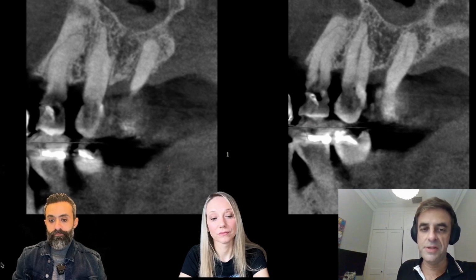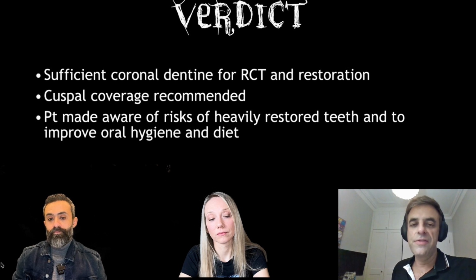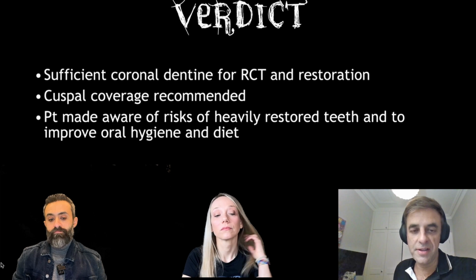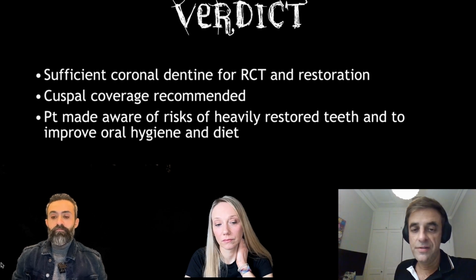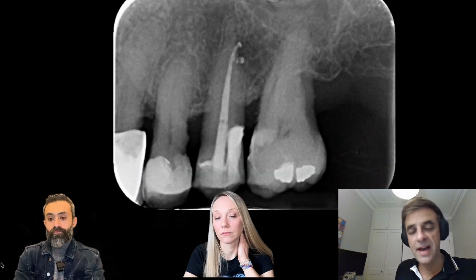So if you flick to the next slide, you'll see that I have filled up. We're going to start, firstly, with the verdict. I was going to talk about that. So first of all, the tooth's restorable. And we want to try and save the tooth. It's got reasonable pericervical dentine. The DO part is the damaged part, and we can fill this with a deep marginal elevation and basically save the tooth. And the patient's 75, so we can easily keep this going for at least 5 to 7 to 10 years or something like this, and this should be sufficient for the patient well into his 80s.